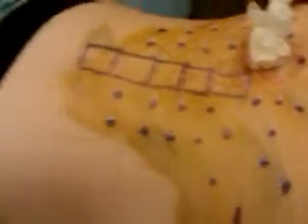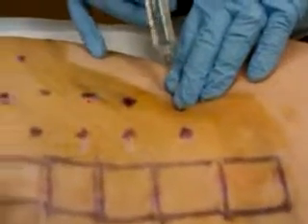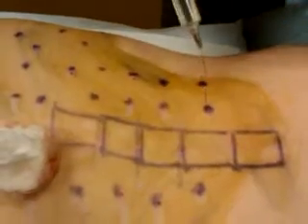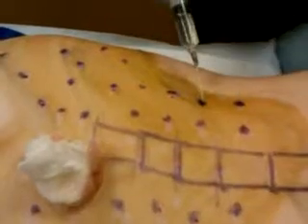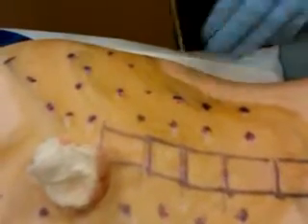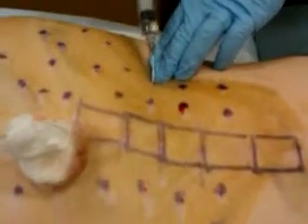I'm going to go from down to the side. There's about one and a half syringes left, so I'm going to need to reload one more syringe. I hit L2. This side is not going to be standard because Laura is mostly affected on the right. I'm used to patients looking to the left, because that's just the way I'm used to doing it — it eases my procedure and makes my job very easy.